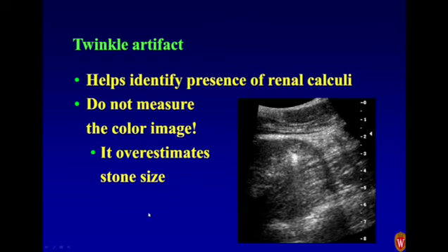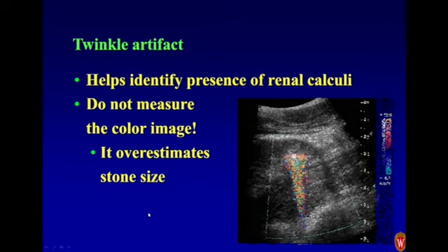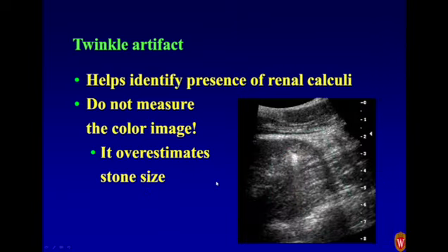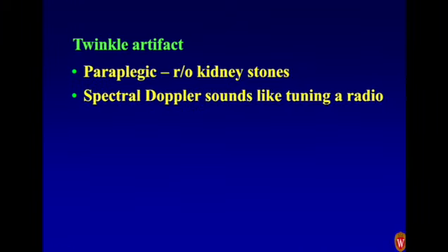Okay, renal calculi. It's excellent at identifying renal calculi, but just be careful. This artifact, although it will just make these stones shine at you, overestimates their size. Do not measure stone size from here to here. You'll be way overestimating the stone size. Okay, you should measure them off the image.